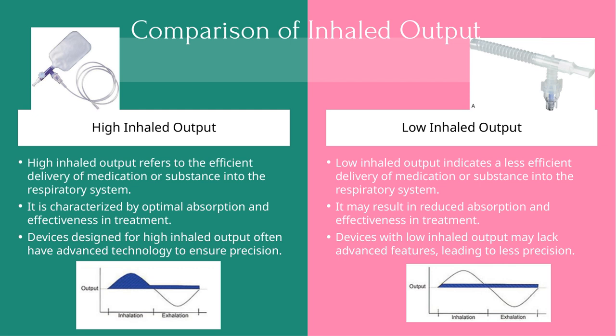If the device isn't delivering enough medication into the lungs, it can result in reduced absorption and, consequently, less effective treatment. Devices with low inhaled output tend to lack some of the advanced features found in high-output devices, which can lead to less precision in delivery.